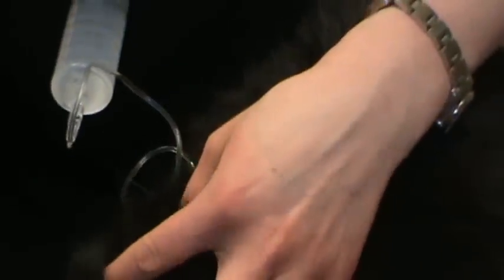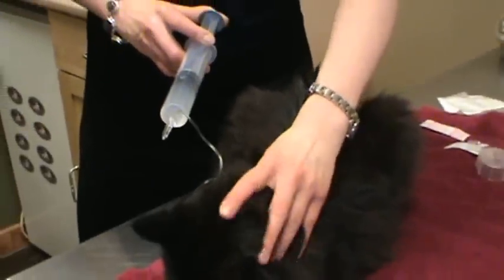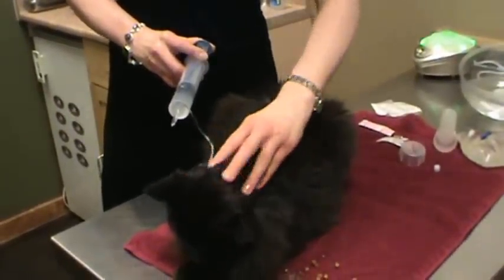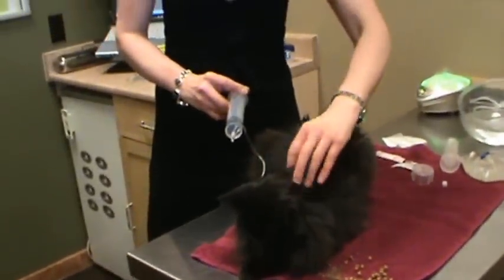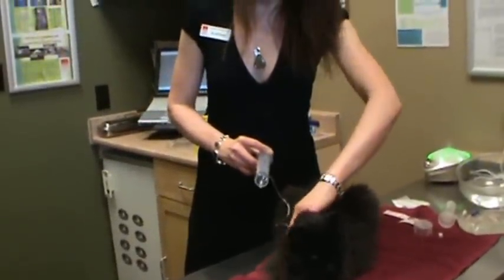You know it's in there when you push the syringe a little bit and no liquid comes out. So I'm depressing the syringe nice and slow but at a comfortable pace for the cat so that he doesn't feel like he's here for three or four hours. We want to do this as efficiently as possible since it has to be done about two or three times a day sometimes, or sometimes once a day. The first injection is going really well with him — he's such a good cat. For the second injection, that's when I like to give the vitamin B.